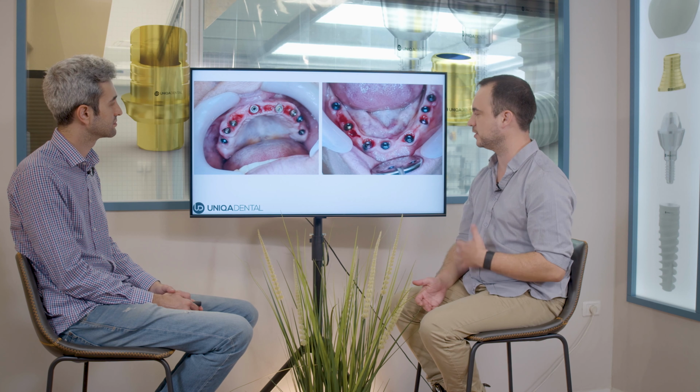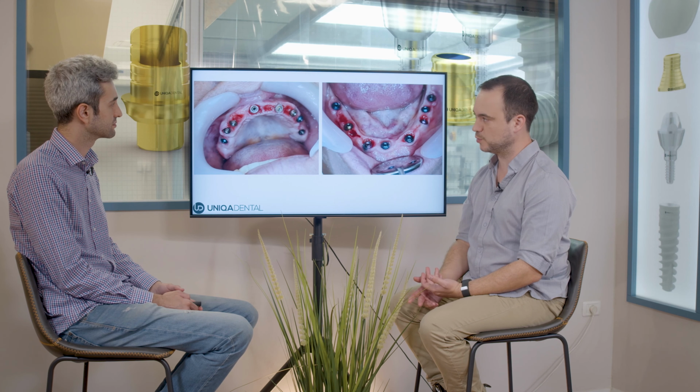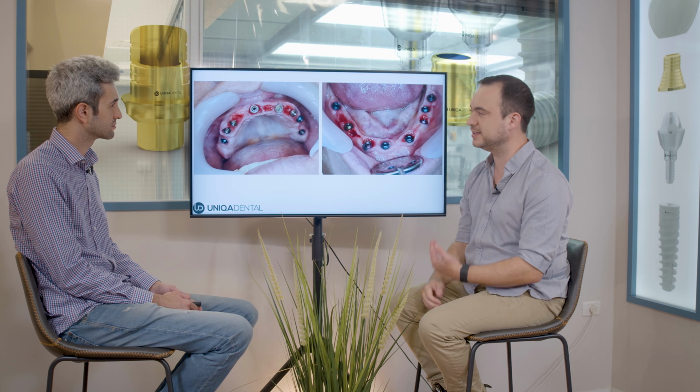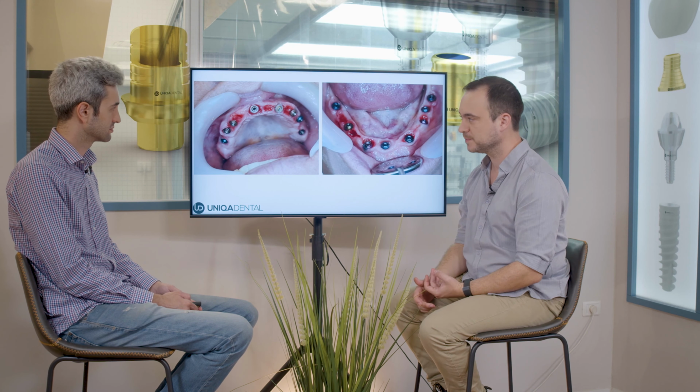You can see that after some time, we took off the bridge, and you can see the healing of the gingiva, that you have the indentation for the teeth, so that it will look like the teeth are coming out of the gingiva.